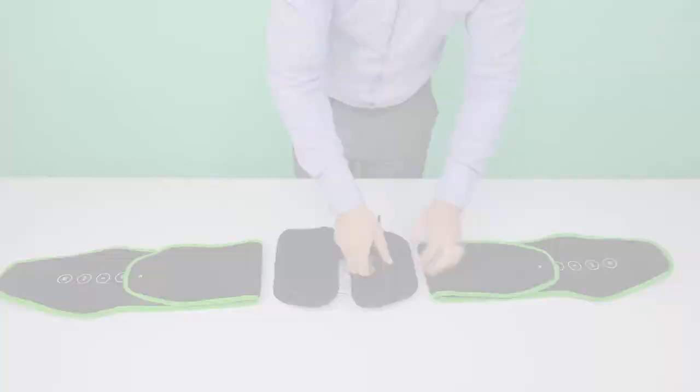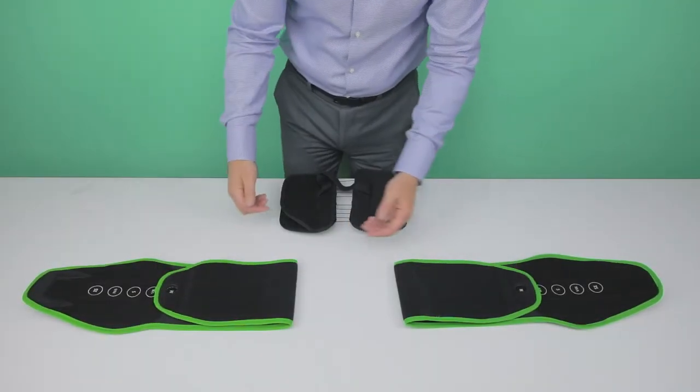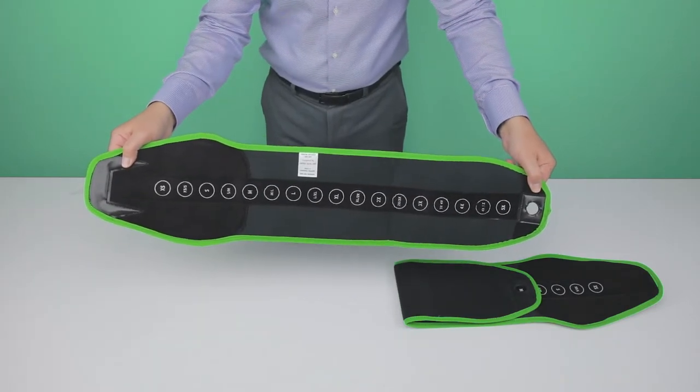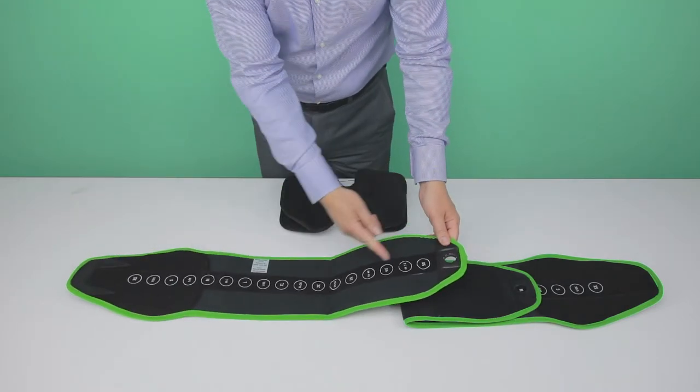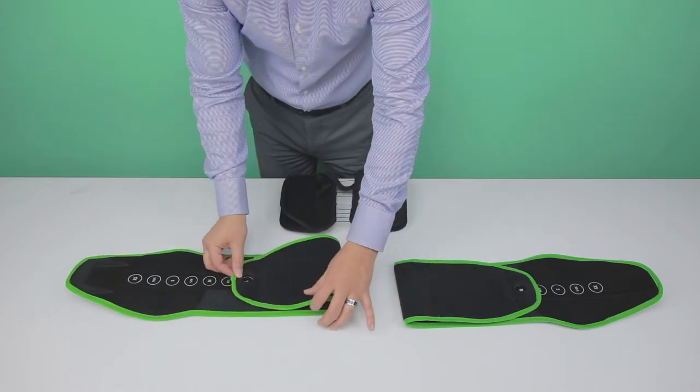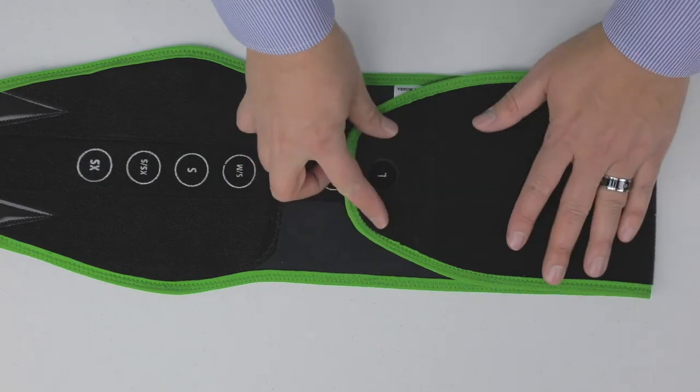The Venom Hybrid Braces come preset to medium size. Select the desired size from the available sizes, extra small to 5 extra large. Place the size indicator over the desired size. Both panels should be set to the same size.